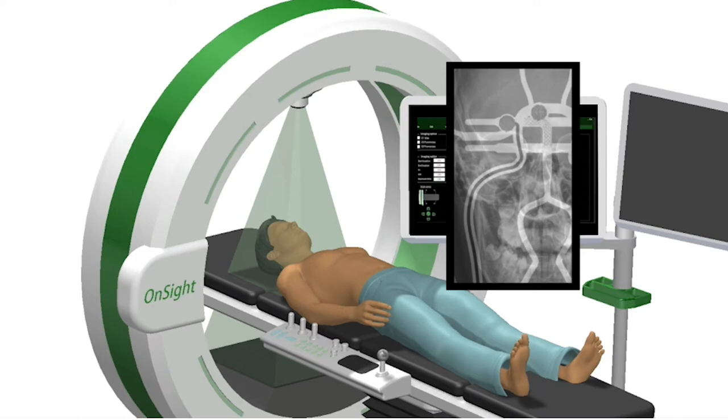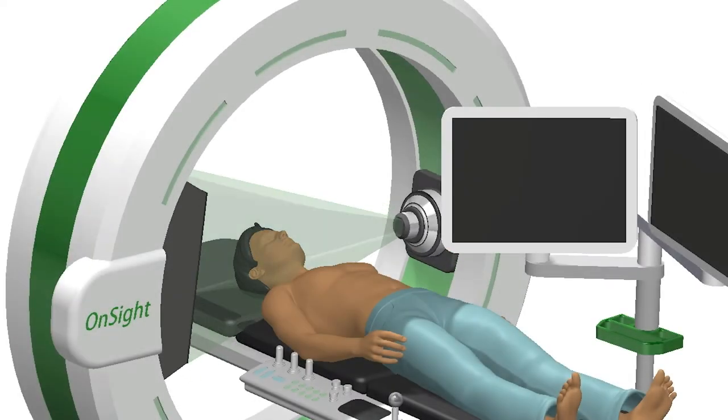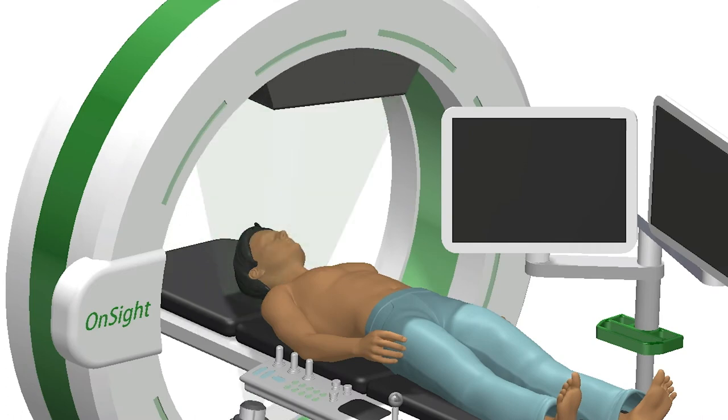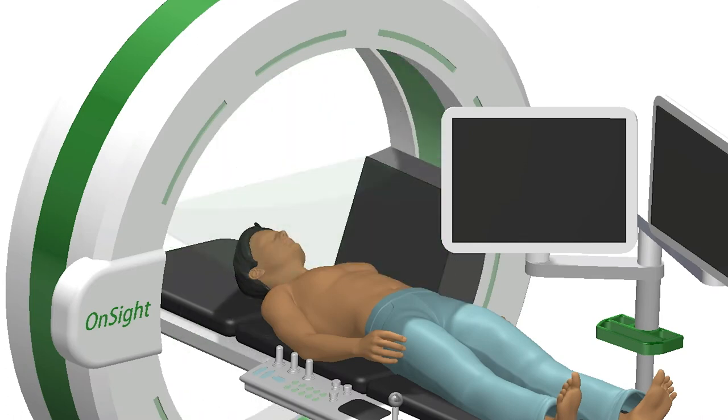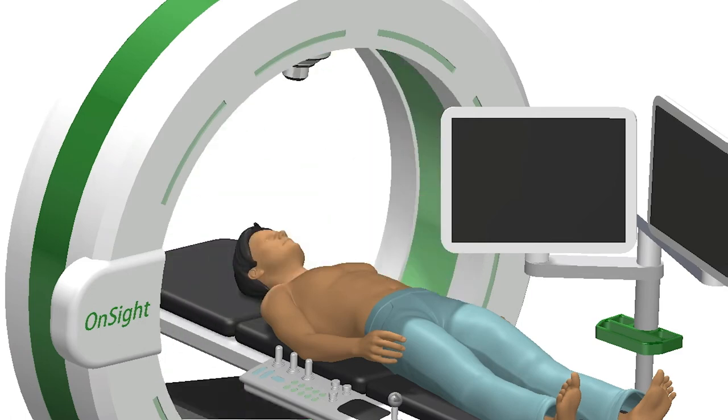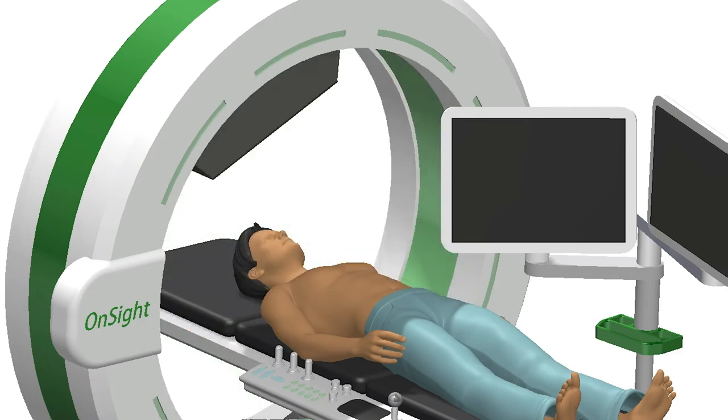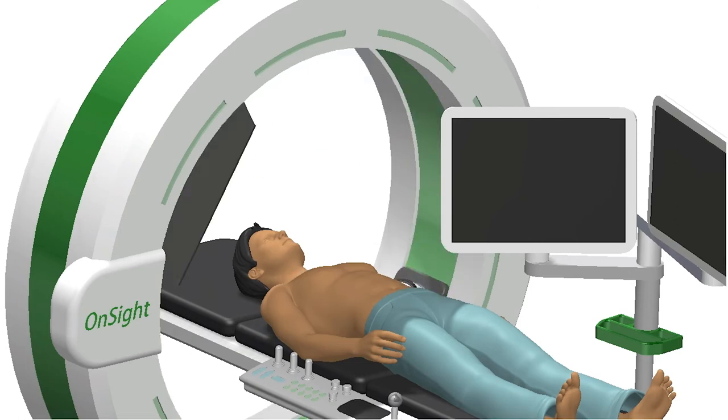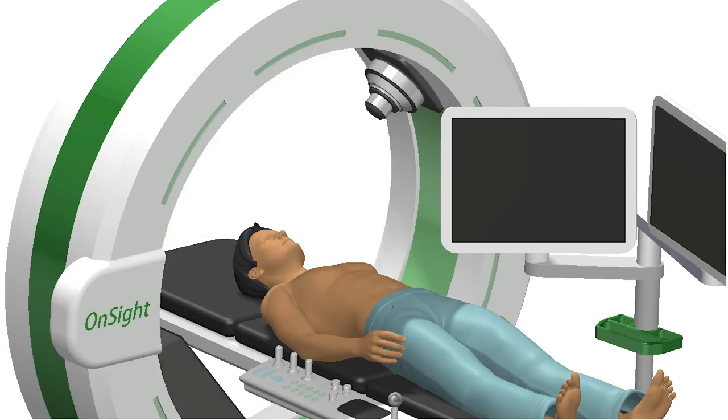After reaching the treatment location, for example the aneurysm neck, the imaging system can be switched to a continuous rotating mode. In this mode, the imaging chain can be rotated at different speeds. In fact, it can be sped up to sub-second rotation times. Short X-ray flashes prevent angular smearing in images.